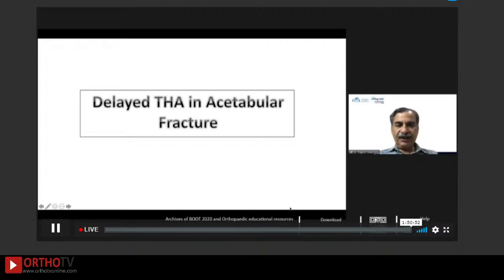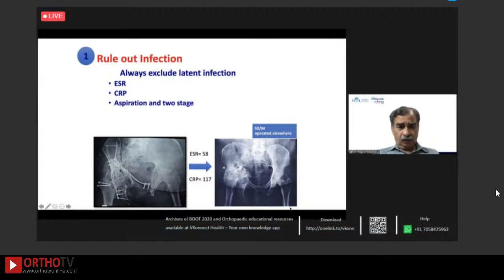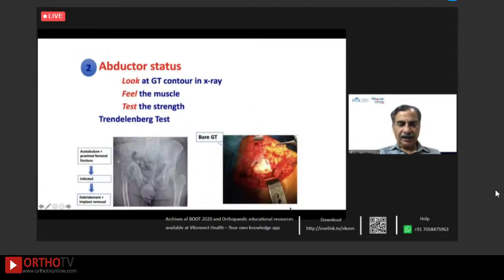Let's talk about the 10 commandments for delayed total arthroplasty in acetabular fracture. The first, of course, in any operated case which fails in orthopedics, the first rule is to rule out infection. So always exclude latent infection, do an ESR, CRP, aspirate, and if you are in doubt, do a two-stage. Like this case, who was fixed, ESR was 58, CRP was 117. It was operated elsewhere. The first stage involved removal of all the implants. And we routinely sonicate these implants at our center, so we have an opportunity to get the type of bug which was infecting.